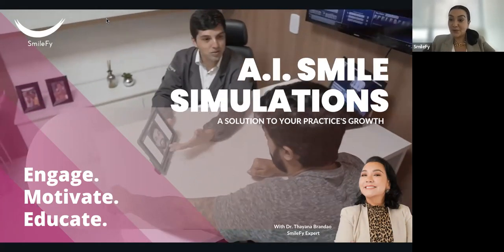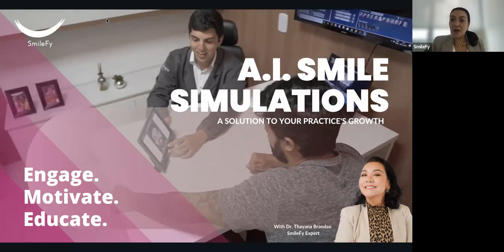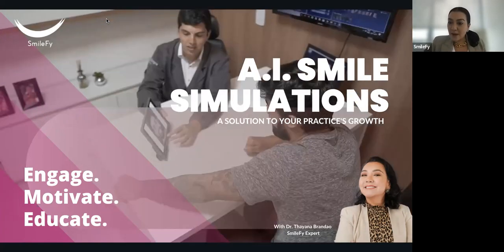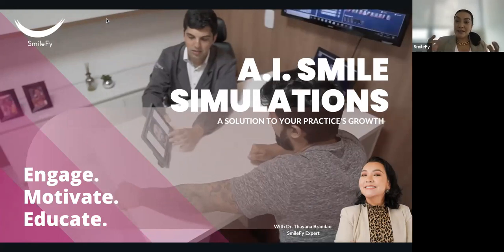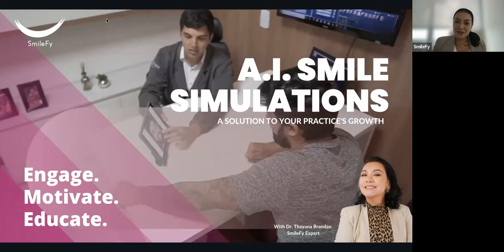I want to tell you in advance that we're going to have a hands-on. So if you have your device with you, please, I want to invite you to download the app. You can go to the App Store and download Smilefy so we can practice on the same patient together. AI Smile Simulation is a different way to engage, motivate, and educate your patient.